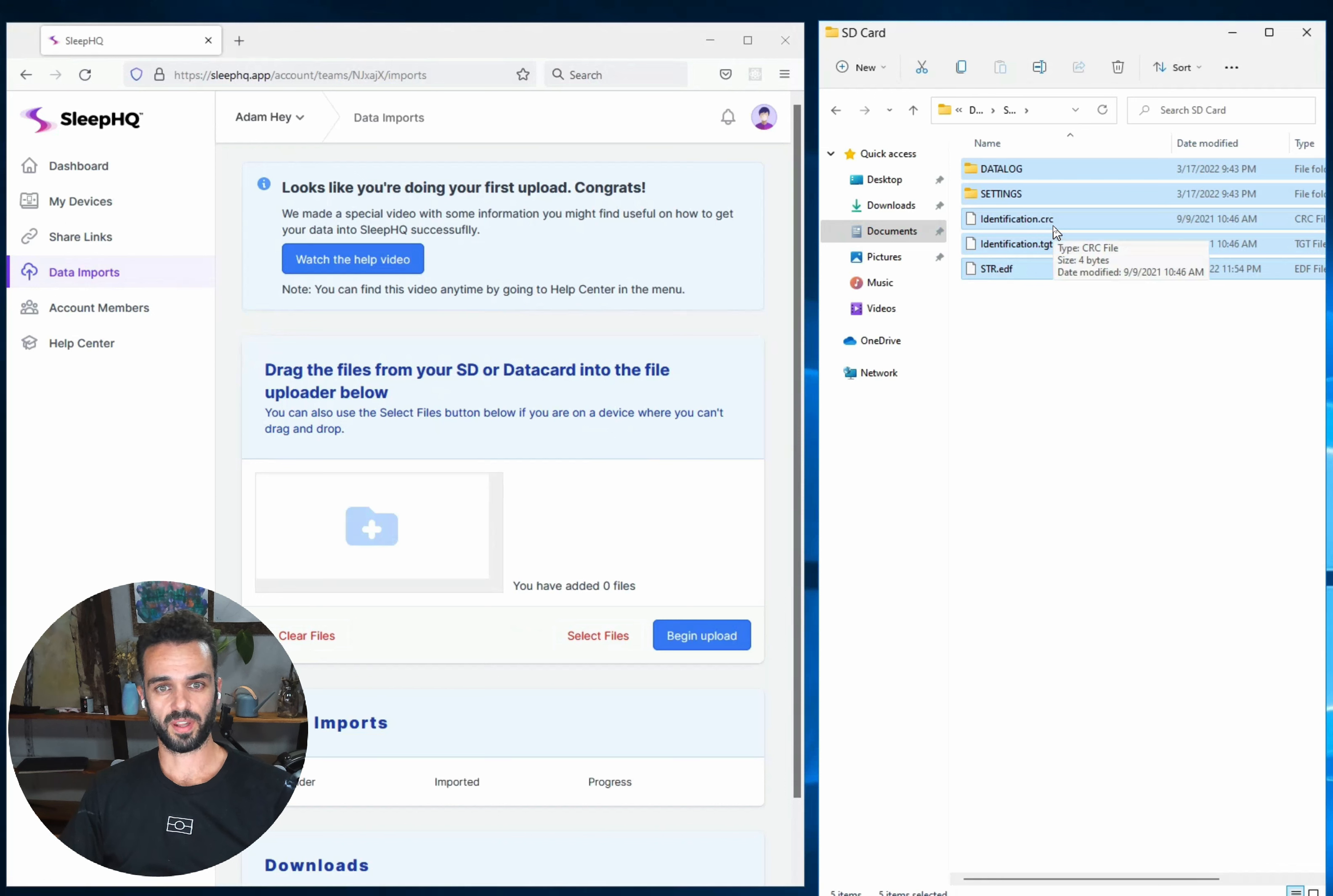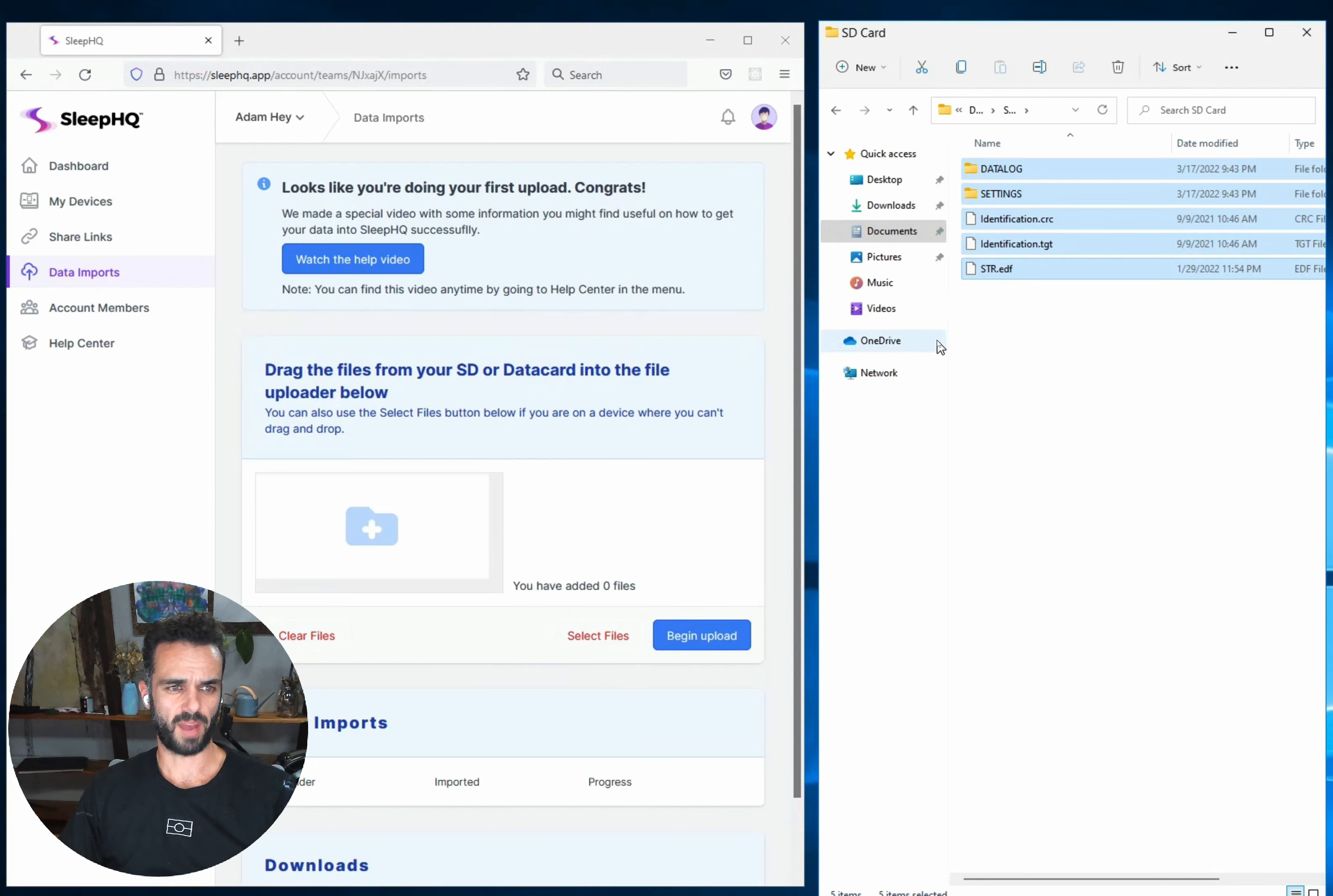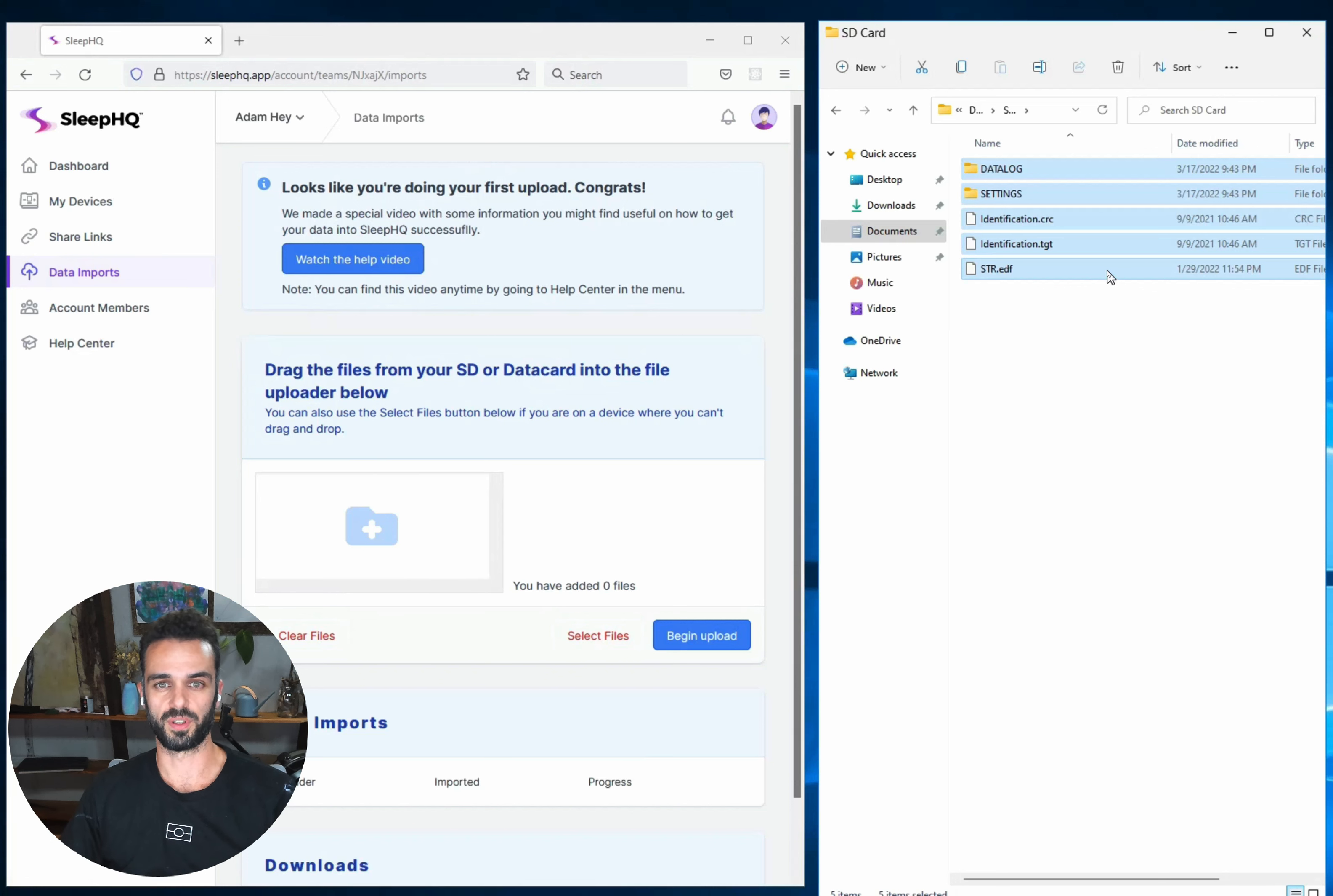One thing to watch out for I think one place where some people have been going wrong is you don't want to select the actual SD card itself and try and drag that into Sleep HQ. That doesn't seem to work on Windows. It sometimes works on Mac but it's a bit temperamental so what you want to do is select the contents of your SD card and drag that into Sleep HQ instead because that will work for everyone all the time.